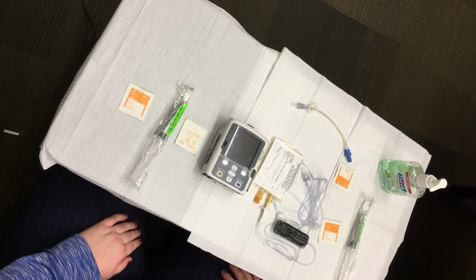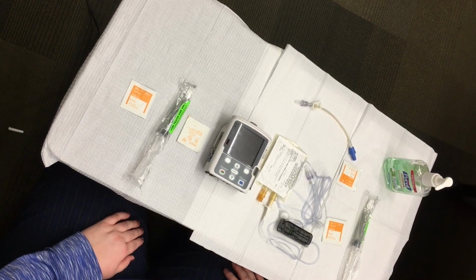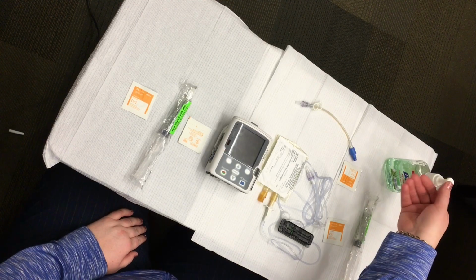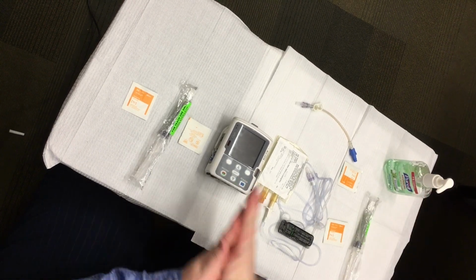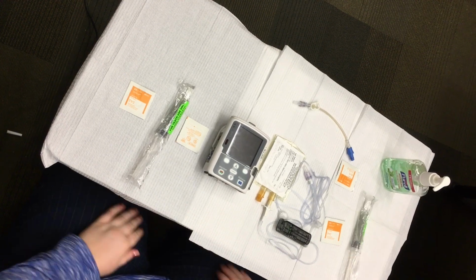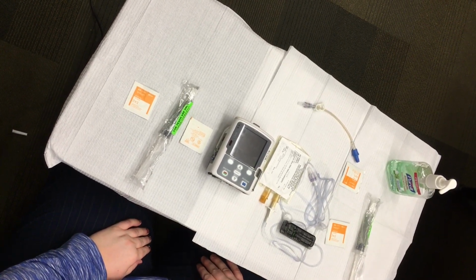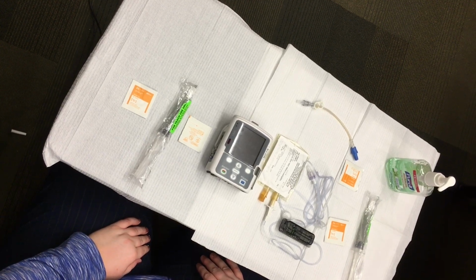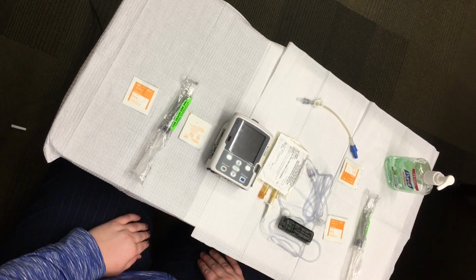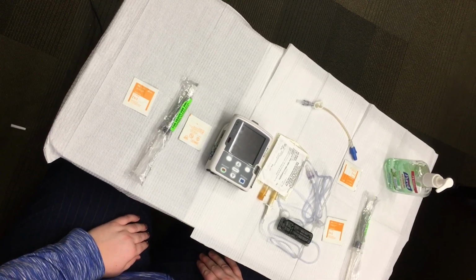Make sure that at no point during this process is the patient hooked up to the infusion. As in the previous video, you should have already washed your hands and prepared a clean workspace lined with paper towels. And gathered your supplies, including the waterless hand cleaner, medication bag, CADD Solis pump, CADD tubing, batteries, flush syringes specific to your therapy and IV line, alcohol wipes, and a new sterile red cap if you've been instructed to use one.